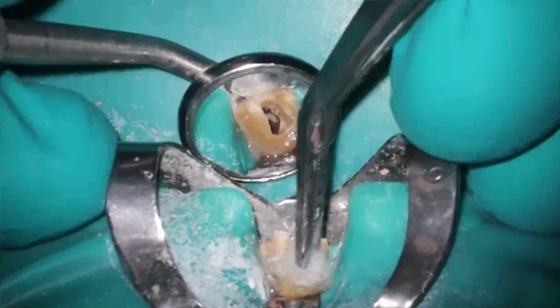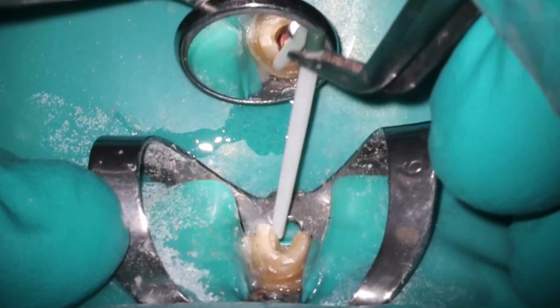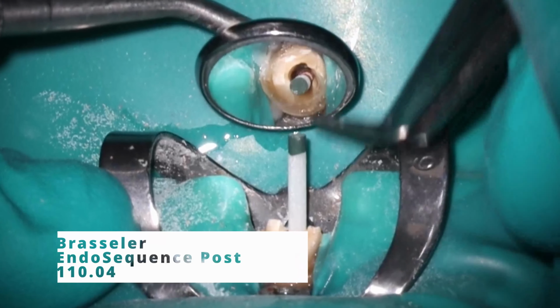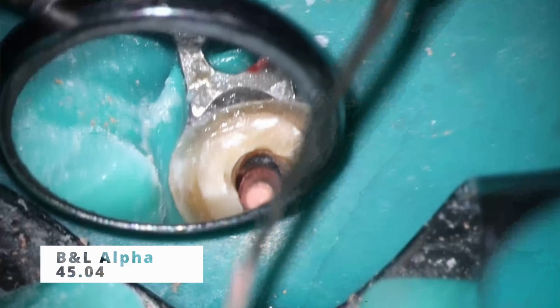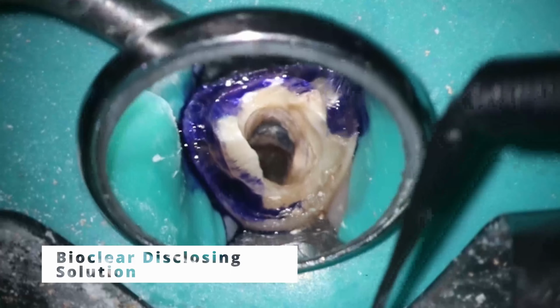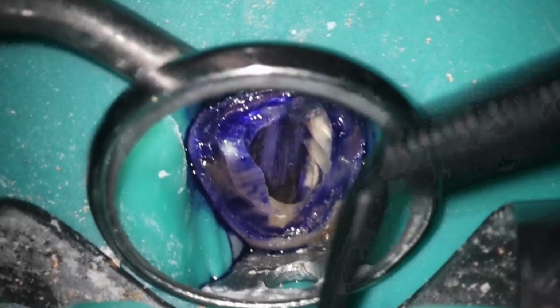You can see the rest of that composite popped out just beautifully. Always lovely when that happens. And looking pretty clean here. So I like to use these Brasseler EndoSequence posts. This is a very large one here, and you can see even that is kind of flopping around a little bit. But I was happy with this. I did notice a little bit of tissue right there. I'm really pleased with the isolation here, so I quick zapped it there. But it looks great as far as the x-ray, and we're gonna start the buildup process now.